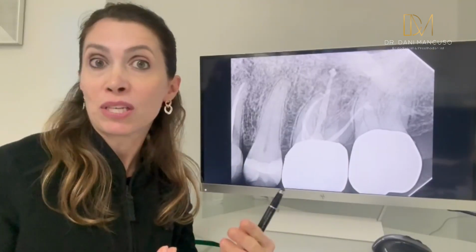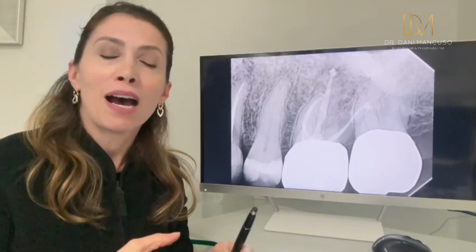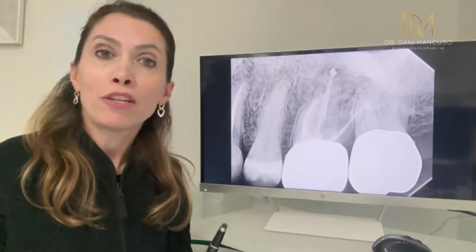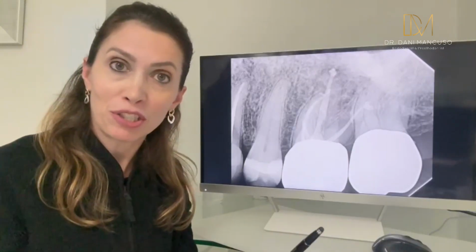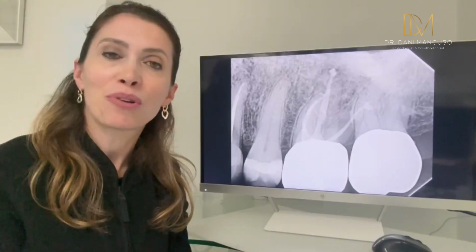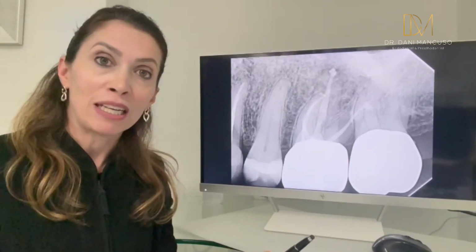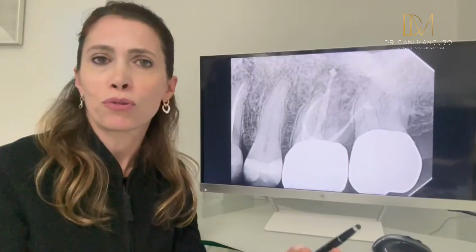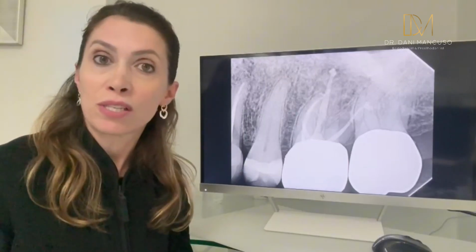You can compensate for that by putting some accessory GPs or a 1504 just to create a little bit of hydraulic pressure for your sealer to flow better in that canal. That way you will make sure that at the apex your GP is a proper size to put hydraulic pressure with your bioceramic sealer to fill the lateral canals and to fill that delta or whichever complex anatomy you have at the apex. And coronally, you can always use the single cone with some accessory points, a 1504 or 2004, just to put pressure laterally, or you can use a warm vertical condensation, which is a good technique as well with the bioceramic.